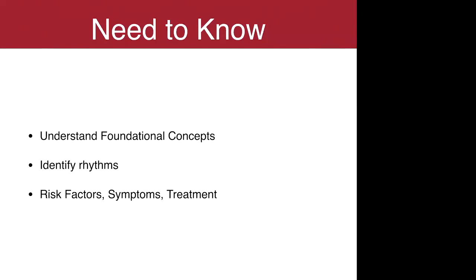So, questions about the systematic approach, questions about what I'm looking for at this point? Does that make sense, Mr. Roberts? Yeah. I'm identifying the rhythms just from the examples in the book. I'm just not sure exactly how to distinguish them from each other. Okay, so that's the next part of what I've got here. I'm going to run you through a bunch of rhythms, and we're going to work them out together and try to sort that out, best we can online.